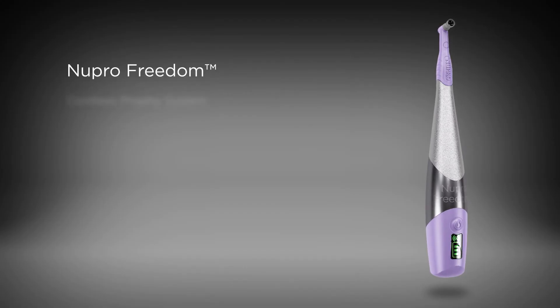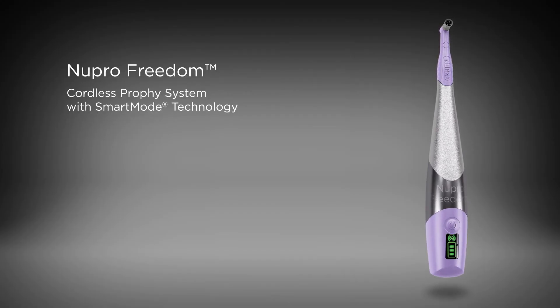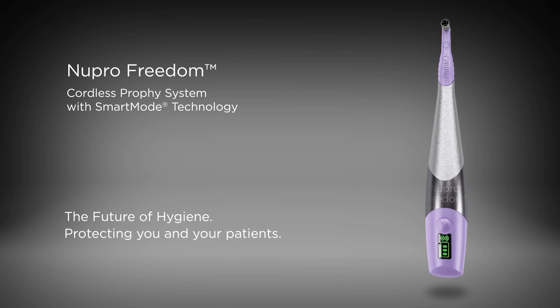Reduce your patient's risk of infection and save your practice from the high costs of purchasing multiple low-speed handpieces with the Nupro Freedom Cordless Prophy System.